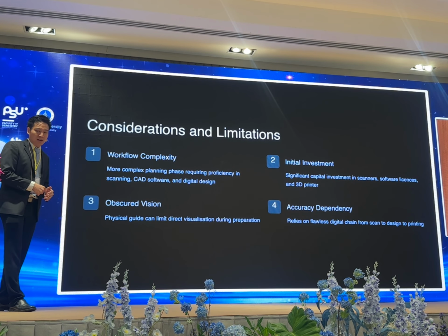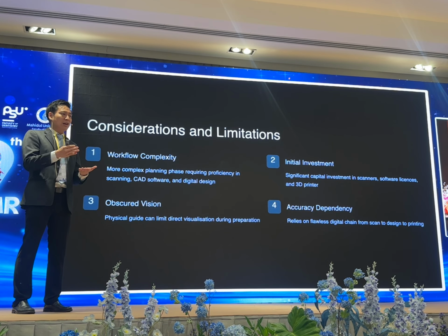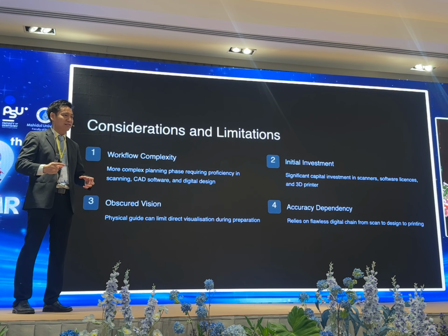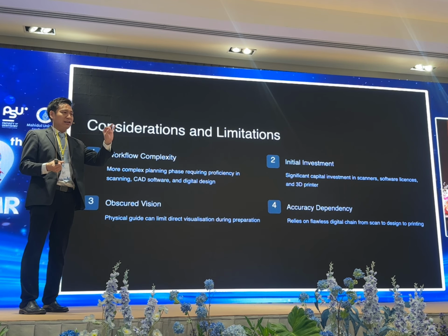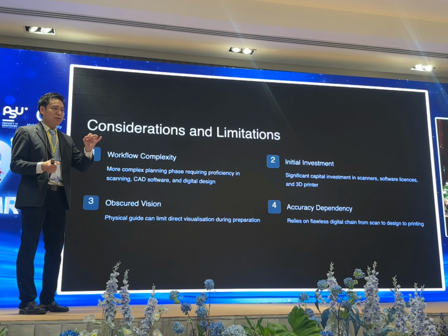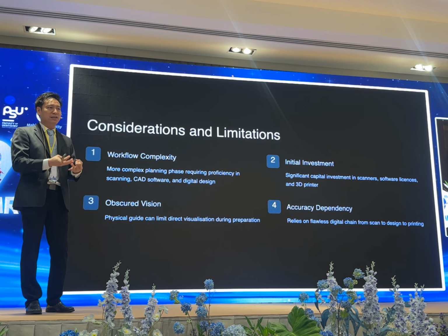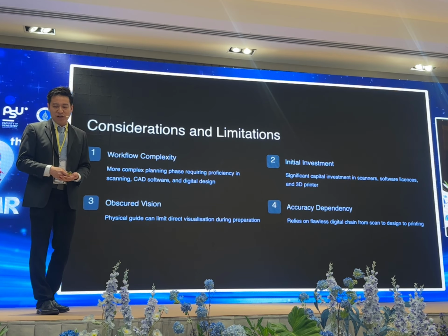Limitation: the workflow is quite complex. You need a lot of lab work, a lot of equipment, and you also need your technician to truly understand how to manipulate the 3D file. Sometimes, because there is a lot of acrylic in front of you, visibility may be limited. You may need to adjust and practice yourself. And the initial investment is a lot. If you already have an intraoral scanner and everything, that's fine. If you don't have an intraoral scanner before, that is quite a deep investment.